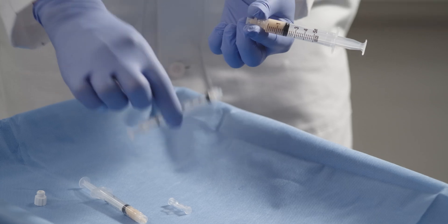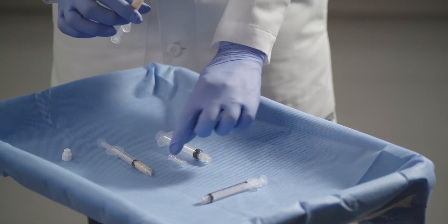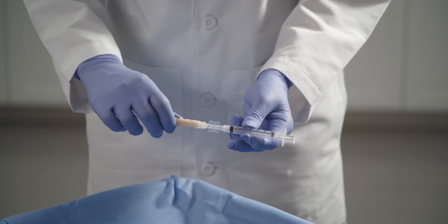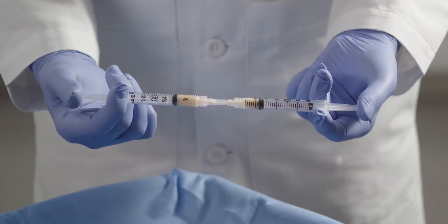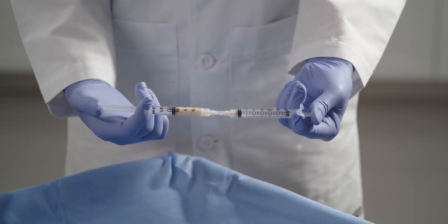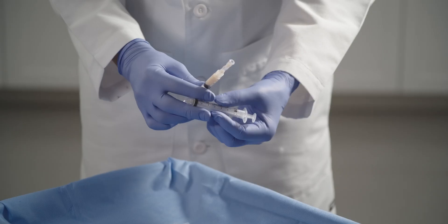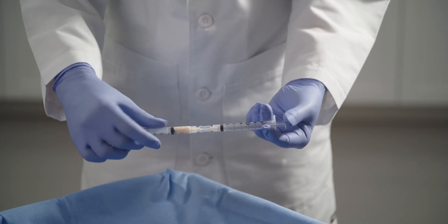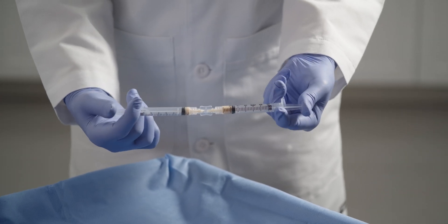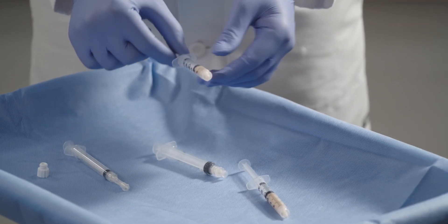You are then going to take your luer lock winged adapter and, using the remaining empty 3cc syringe, emulsify each of the syringes containing the Renuva. Start in small increments until you can pass the full amount of Renuva through the adapter. Pass the Renuva through the adapter for a minimum of 10 times.